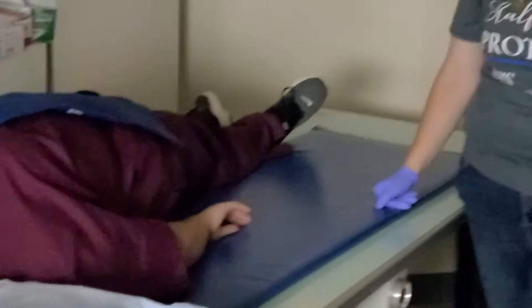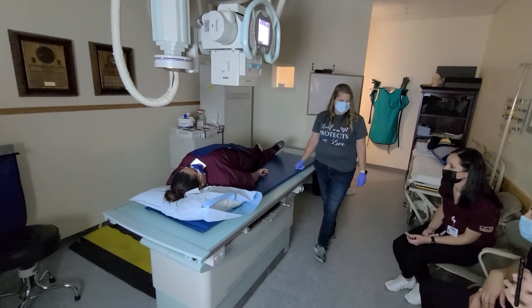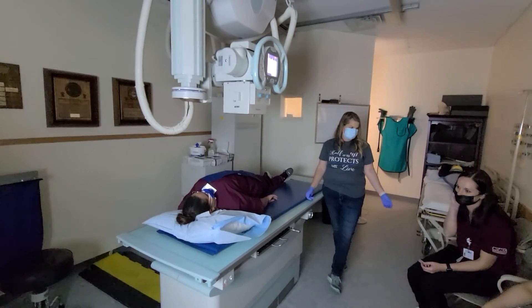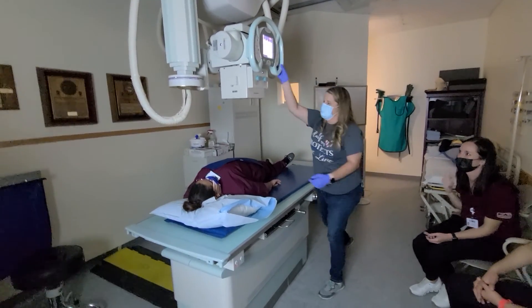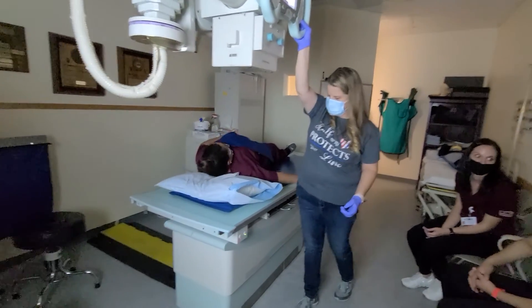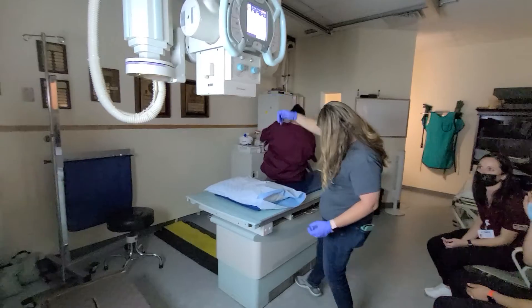Any questions on that one? We are challenging all three of these together. I'll move this — you can get off on that side or this side, whichever is easier for you.